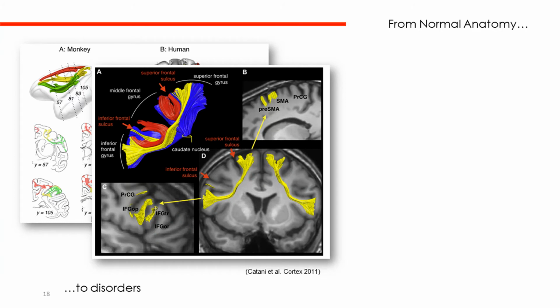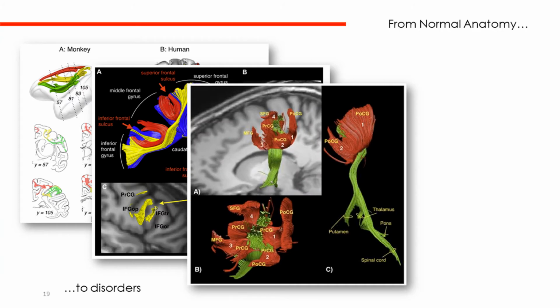After that, we started to look not just at big tracks, but also smaller tracks, for example, U-shaped fibers or intralobar tracks, because with spherical deconvolution you can see not only the main component, but also the secondary component, the subcomponent in the white matter. So you still see smaller tracks, and here you can see what we call the poppy flower. It's a set of U-shaped fibers around the hand region, connecting the premotor, sensory area, and motor area, all connected. It's a nice network of connections that we think coordinates fine motor tuning.